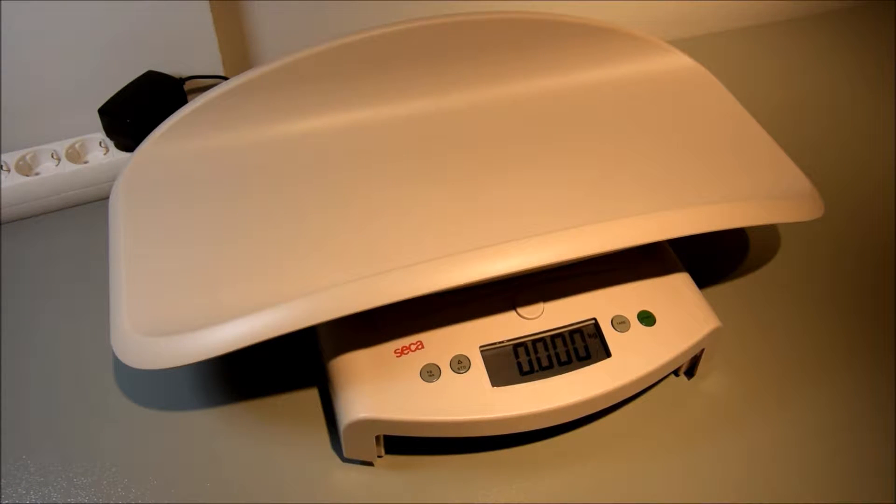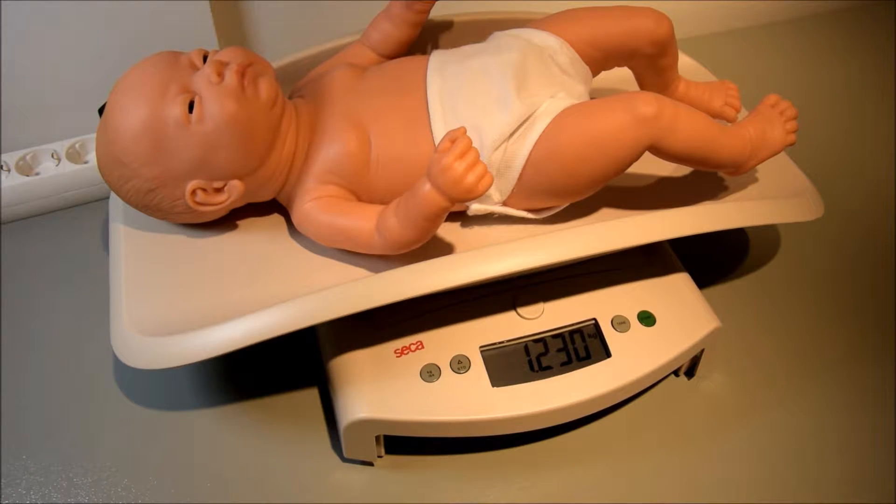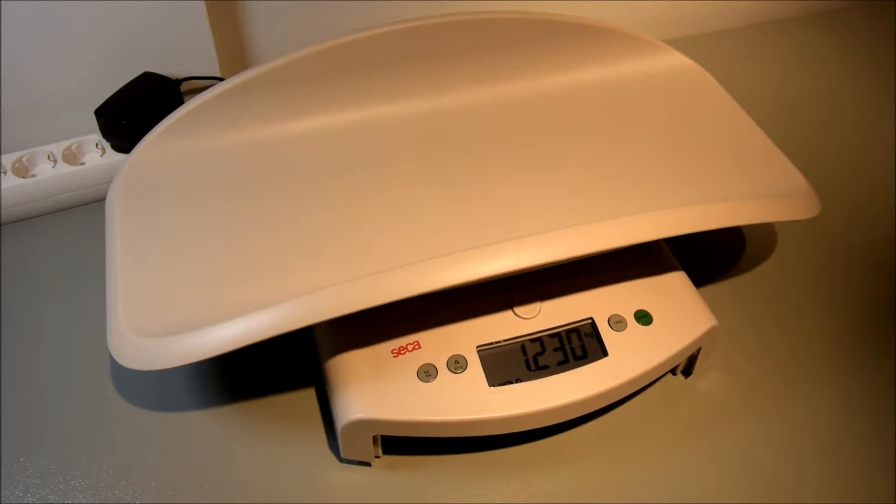Now take the baby and place it on the tray. Due to the electronic damping and hold functions, the scale locks the weighing result at the correct rate, no matter if the baby is moving or not. Because of the hold function, the nurse can first take care of the baby before she records the weight which is shown on the display.